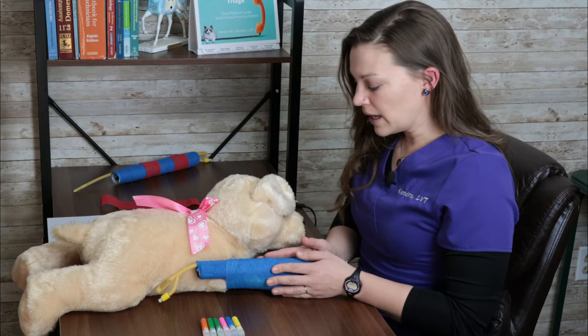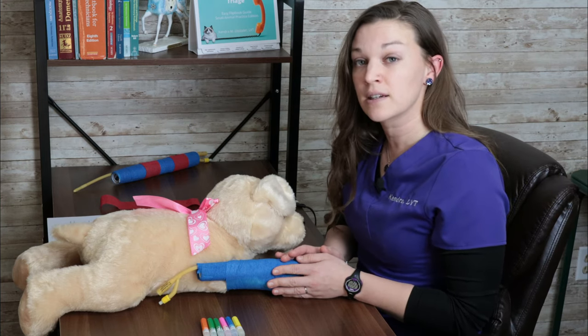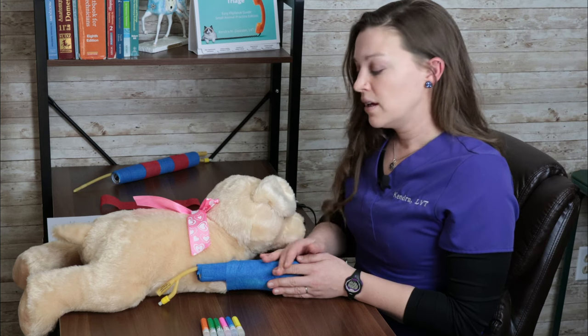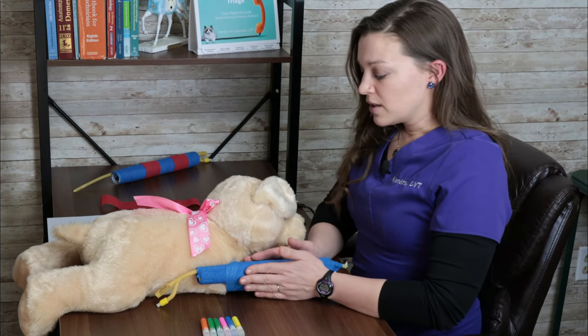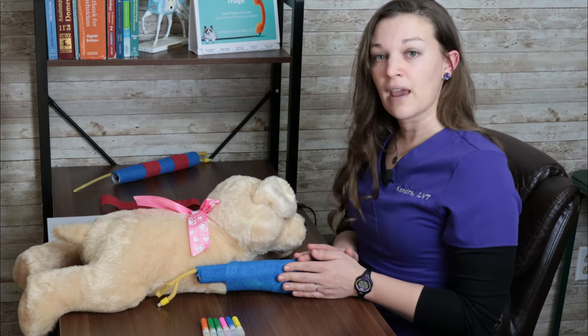And the reason why we want to do this is if we accidentally blow the vein in an unsuccessful attempt, we can always move up the same leg and reattempt to place a catheter. If we start too high, we'll have to move to a different leg, a different site to get that catheter placed. So when we're placing an IV catheter, we want to first start with clipping the area.